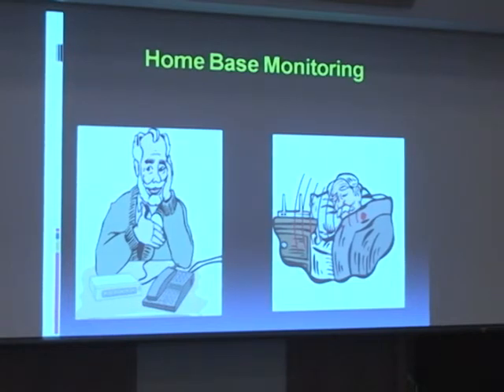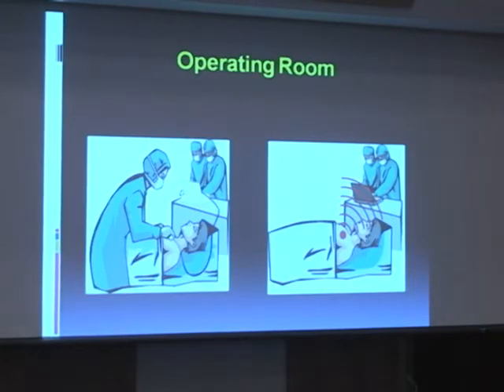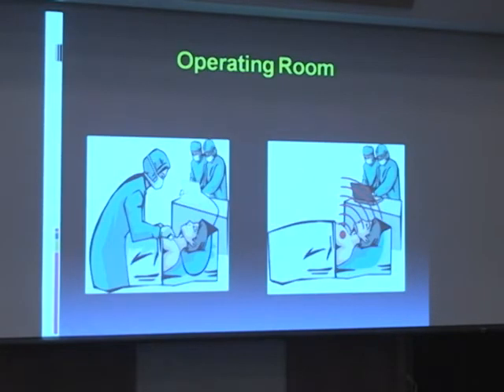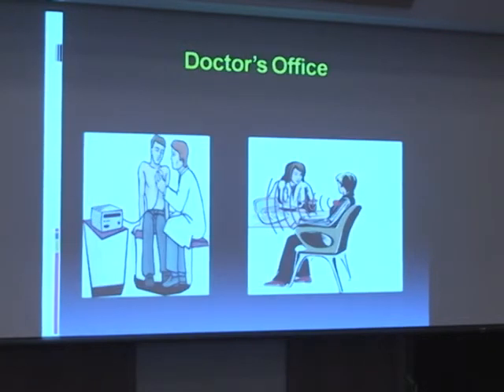One of the applications is that you can implant into the pacemaker, so instead of the patient needing to report to the physician about his health, the patient can sleep really well and the device can automatically dial if there's an emergency. You can also use it in the operating room to monitor information, and later on in a doctor's office.